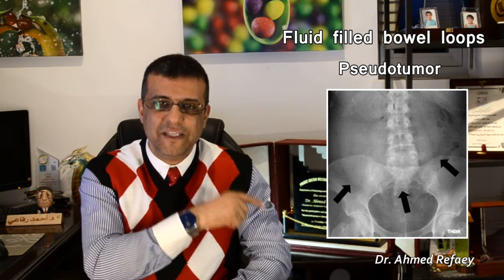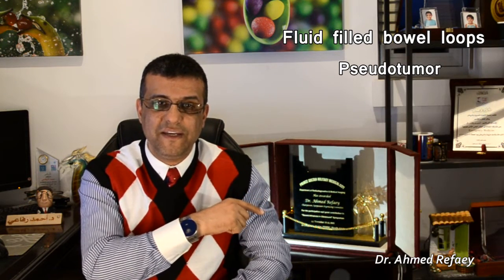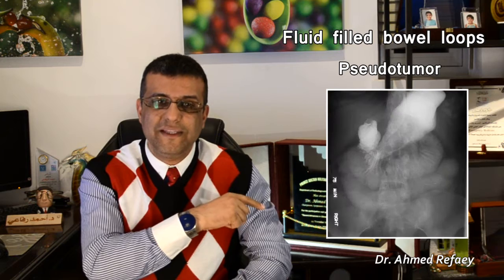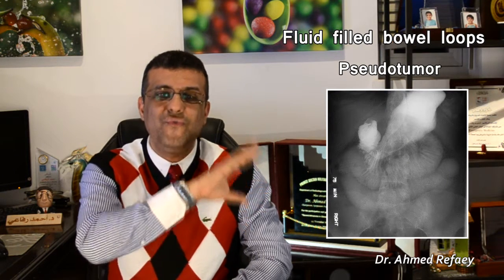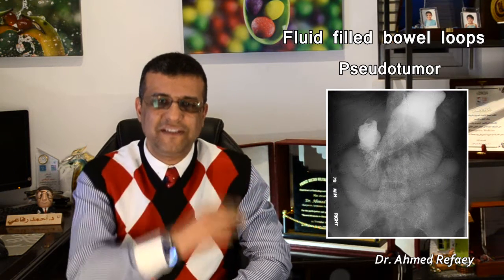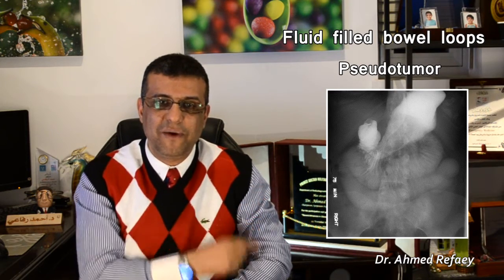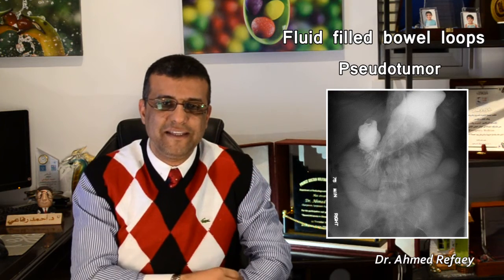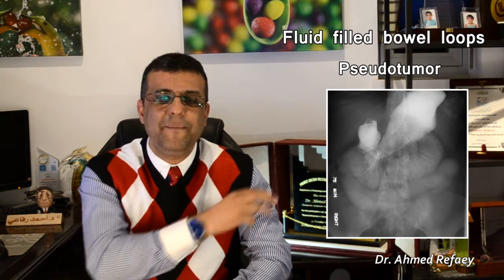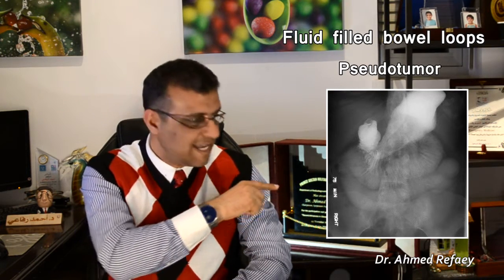The same patient underwent an upper GI series with oral gastrografin, which showed that the soft tissue mass is actually due to fluid-filled dilated small bowel, as seen in this image. There is marked dilatation of the small bowel loops, centrally located in the mid abdomen, with appreciation of the valvulae conniventes, as seen here.